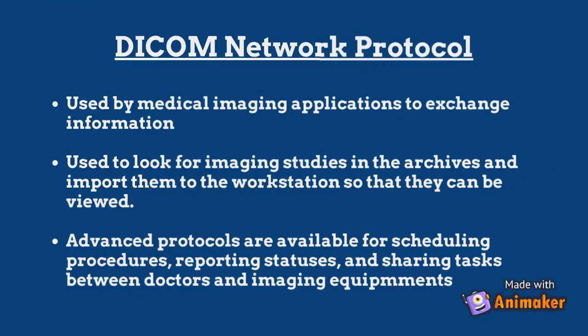The network protocol is used by medical imaging applications to exchange information and also to look for imaging studies in the archives and import them to the workstation so that they can be viewed. Advanced protocols are also available for scheduling procedures, reporting statuses, and sharing tasks between doctors and imaging equipment.